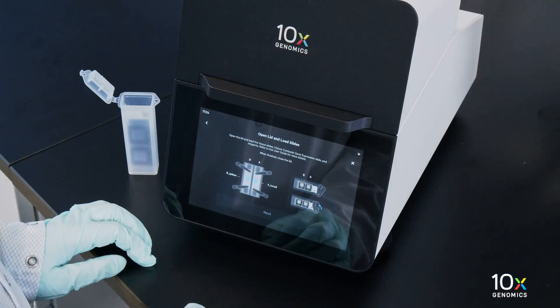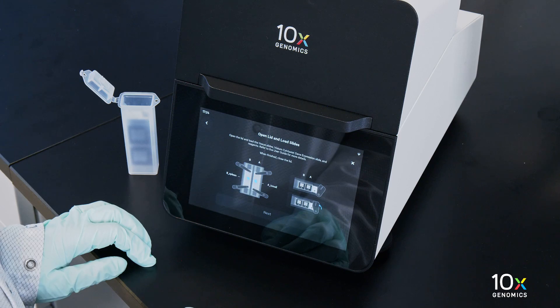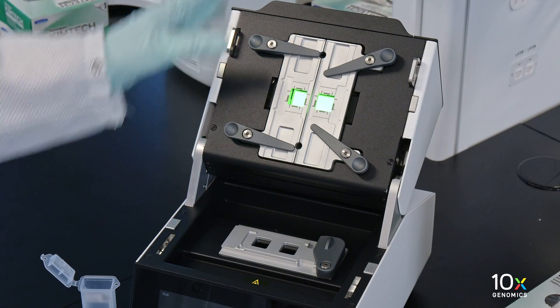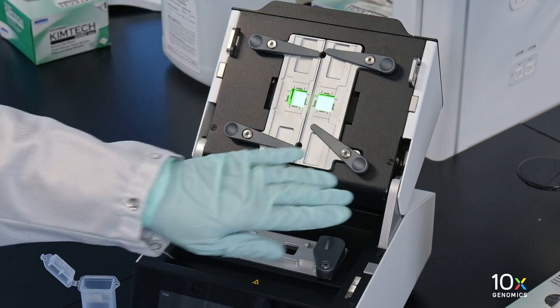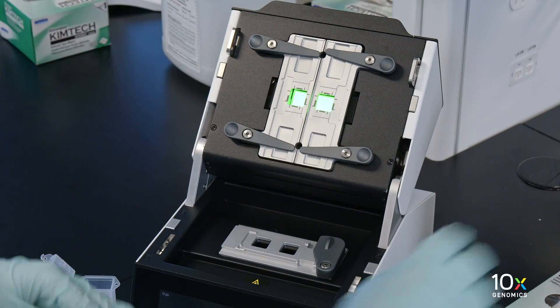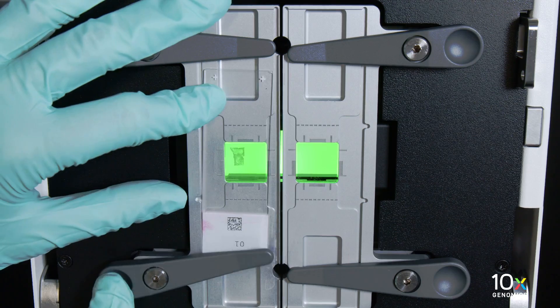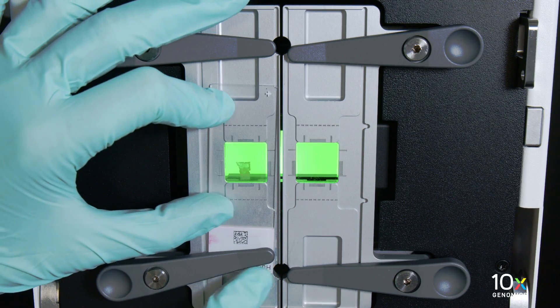Now we will prepare tissue slides for loading onto the tissue slide stage. The slide assist instrument should display a load slide screen. Press down on the wide end of the clip to lift and pivot the narrow end of the clip. Pivot the clips to their outermost position. Use one hand to hold the slide in place and the other hand to pivot the clips and overlap the slide.